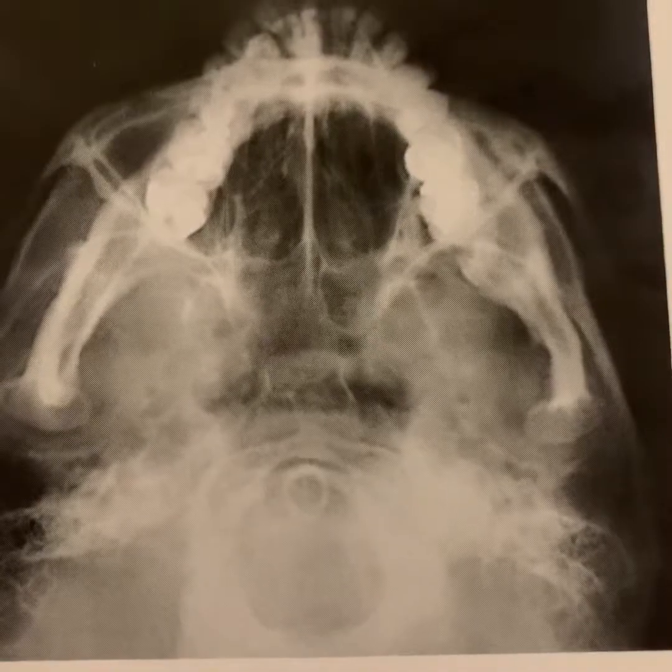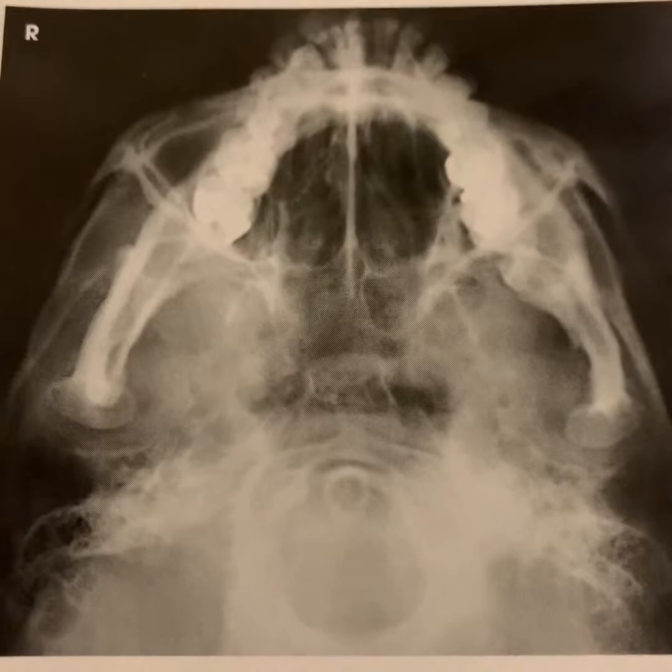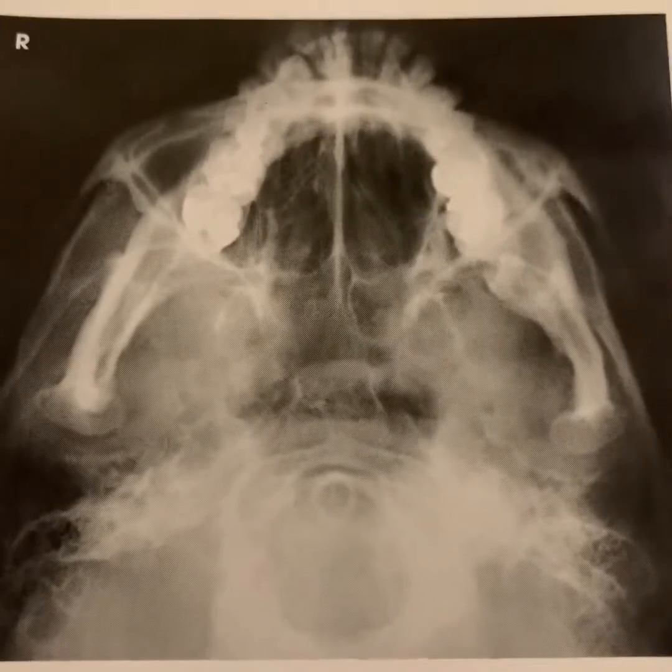And we want the mandibular condyles anterior to the petrous pyramids. And with that, those are our four images, and we're done.